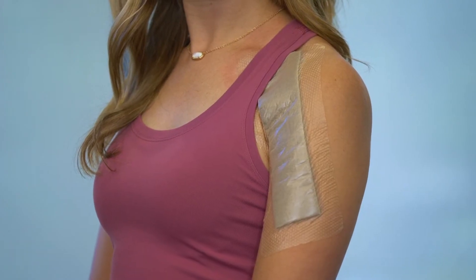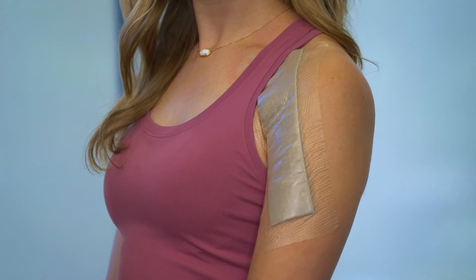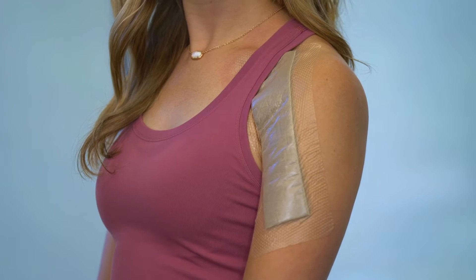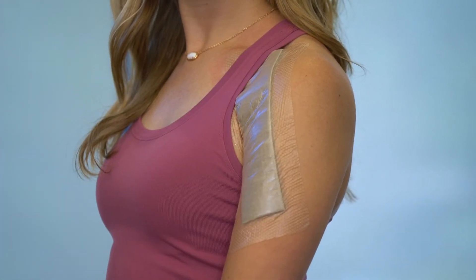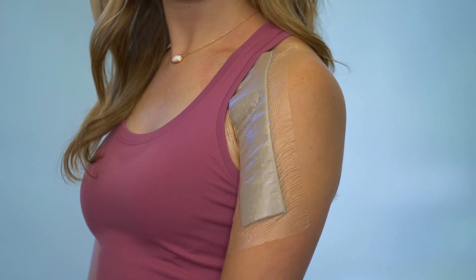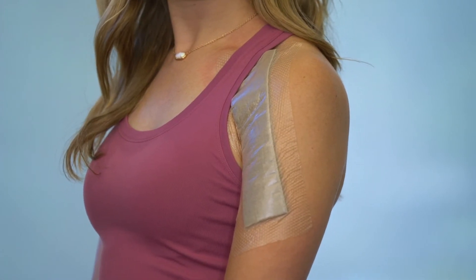Your wound was also covered with two types of dressings. One is this mesh with a skin glue called Dermabond. And then the top layer is called Silverlon or Mepilex dressing. Both of these dressings are waterproof and they have a little bit of silver in them to help fight off any infection.